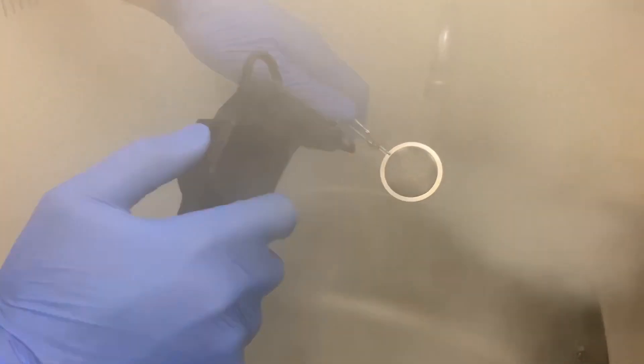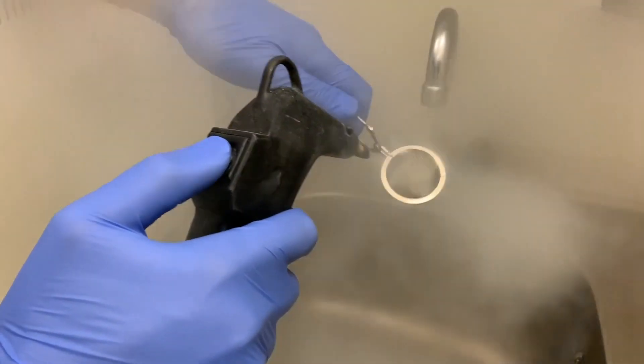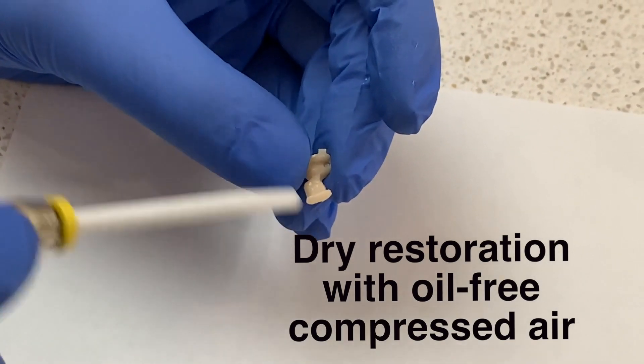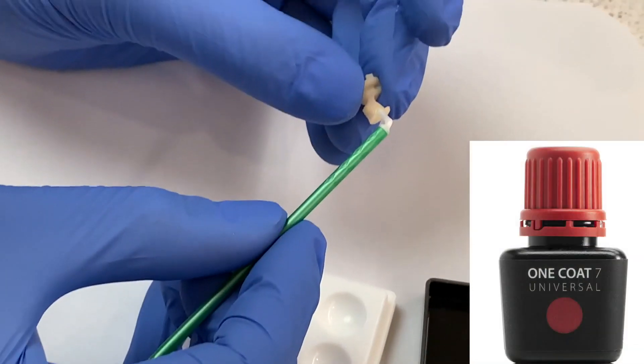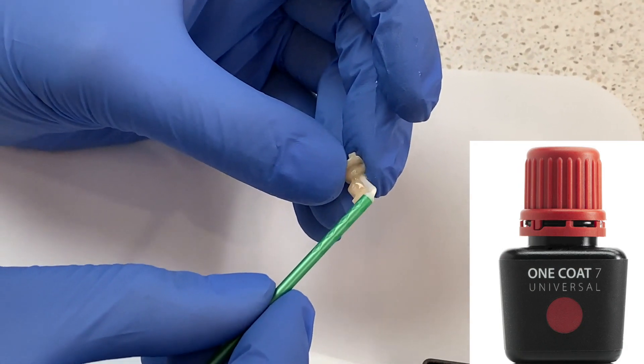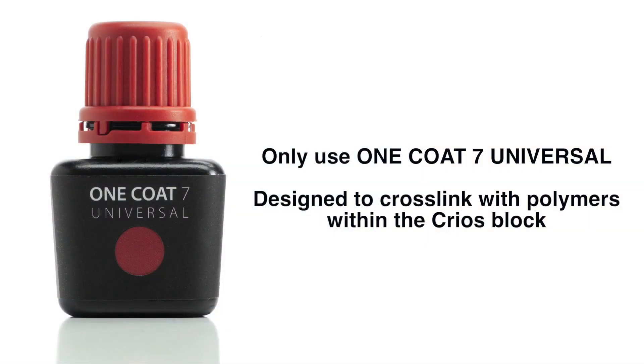This thorough cleaning will remove any contaminants that may affect the bond strength of the restoration. Dry the restoration with oil-free compressed air and apply one coat seven universal from Coltene to the internal of the restoration for 20 seconds. Do not use other bonding agents or silane other than the one coat seven universal to treat the internal, as the one coat seven universal is designed to cross-link with polymers within the Krios block to help form a proper bond.